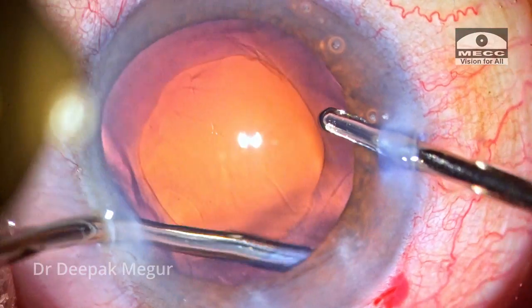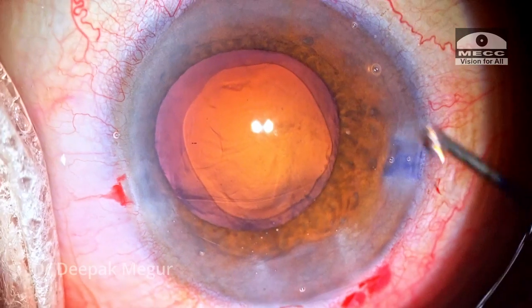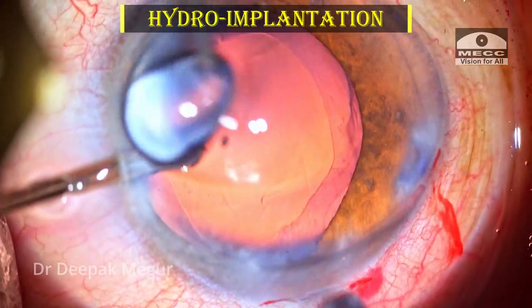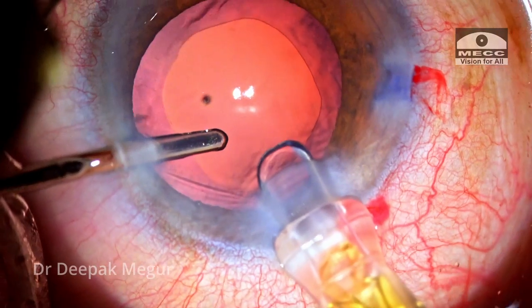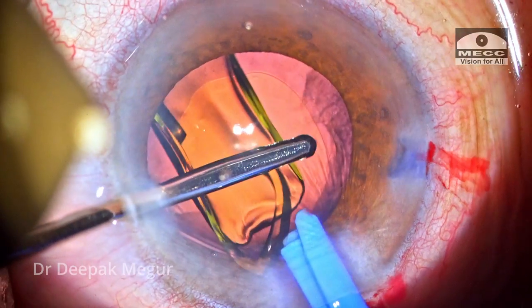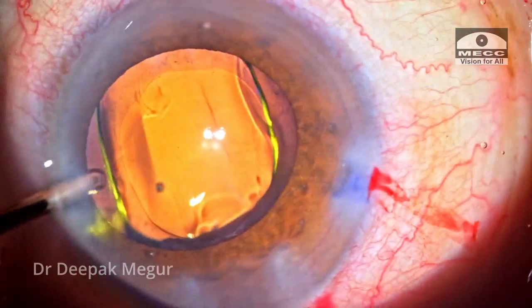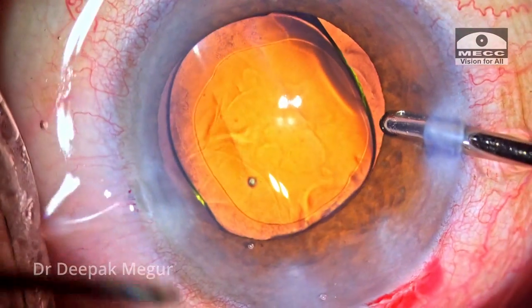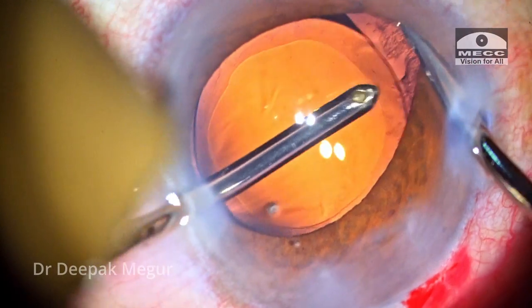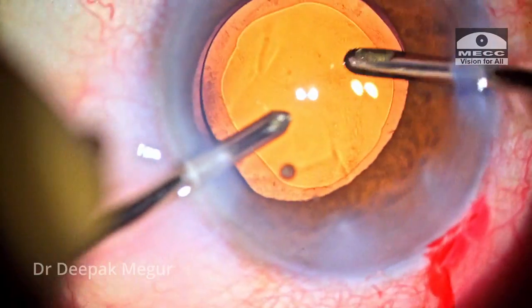Whatever little cortex remains is aspirated out and the bag looks clean. Time to implant the intraocular lens. A pre-loaded single-piece hydrophobic lens is being implanted into the bag using the hydro-implantation technique, wherein the left hand maintains irrigation to keep the chamber and bag formed while the lens is gently implanted. The distal haptic goes in first, followed by the proximal haptic. The last bit of cortex is aspirated and the bag looks clean.